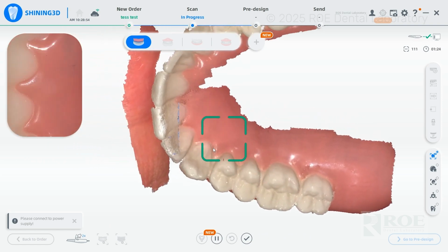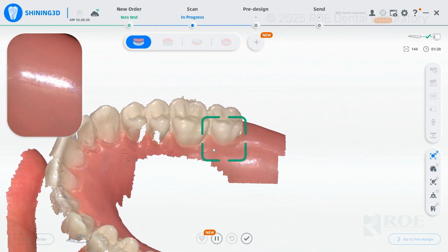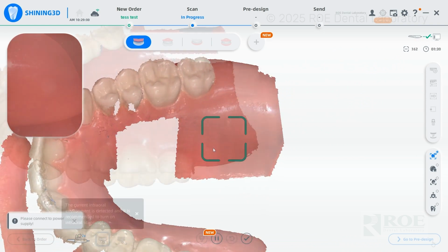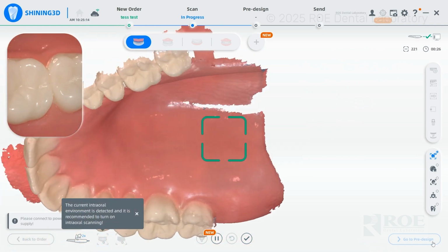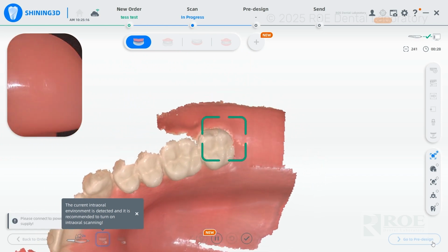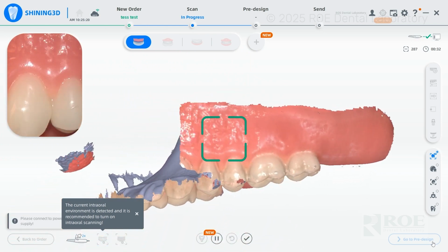And it's really important that you capture the 360 scan in one scan so that we aren't stitching data together here at the lab. We want to make sure we get the intaglio side of the denture as well as the cameo side when we're doing this scan, all in one piece of data.